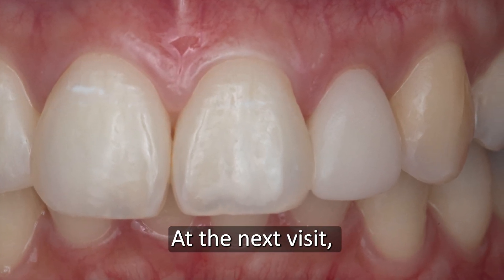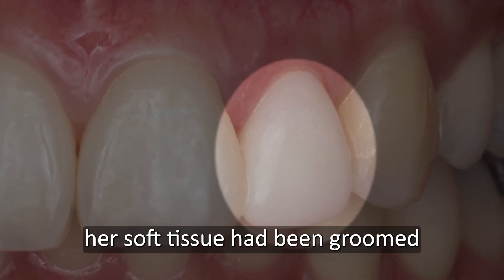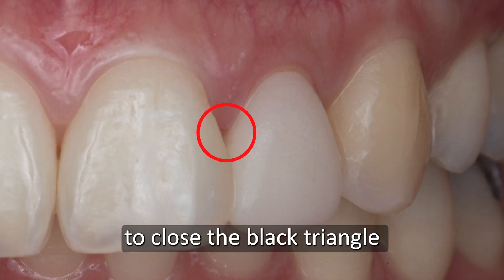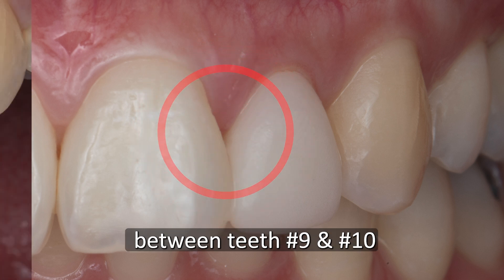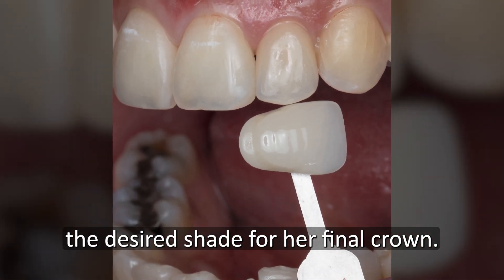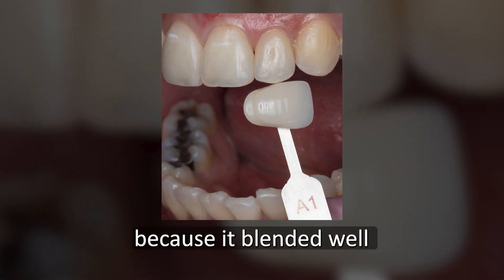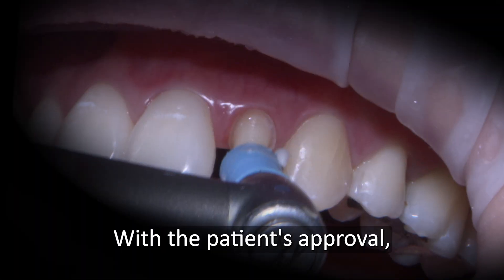At the next visit, Justine was happy with the appearance and fit. I was happy to see that her soft tissue had been groomed to close the black triangle between numbers 9 and 10. Together, we determined the desired shade for her final crown. We decided on shade A1 because it blended well with the surrounding teeth.